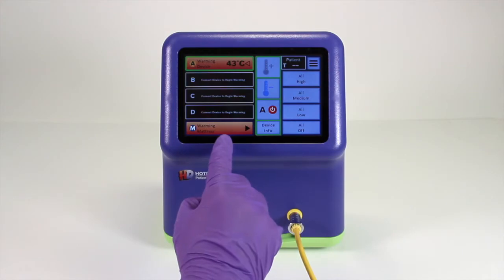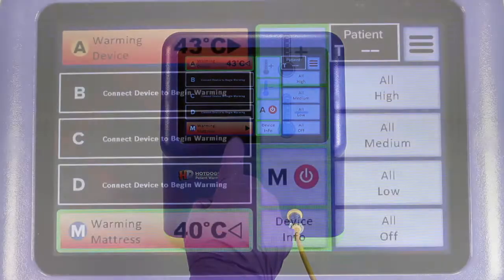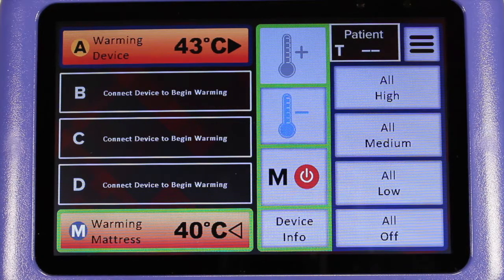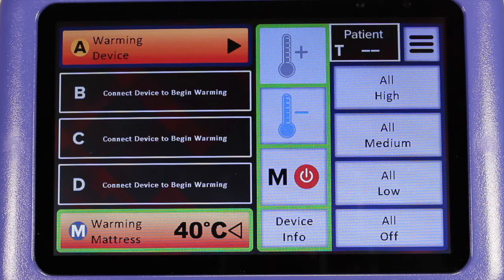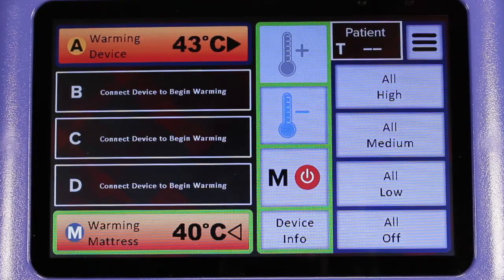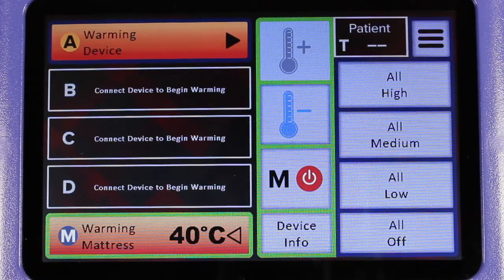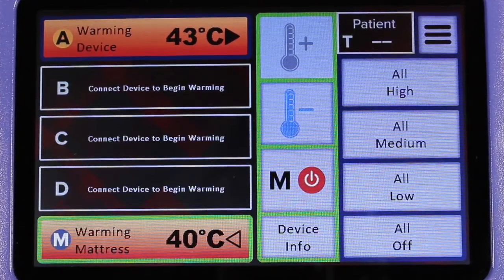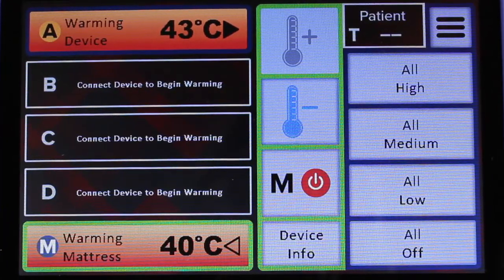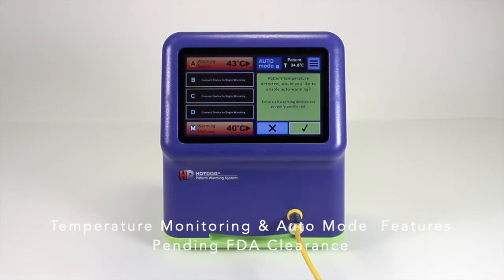The set temperature will flash until it has been reached. The WC7-7 software now allows for a maximum mattress temperature of 40 degrees Celsius. This new setting allows for even more heat transfer from the mattress at a temperature that is still below the international standard. Hot dog patient warming technology allows for safe thermal transfer under the patient, but as always, consult the instructions for use to ensure proper precautions are followed.